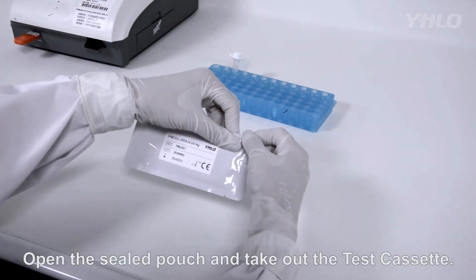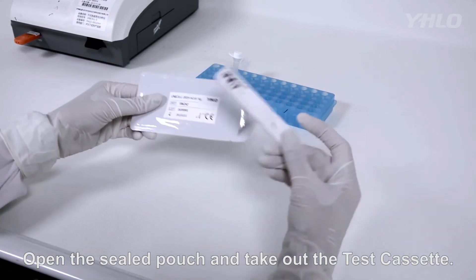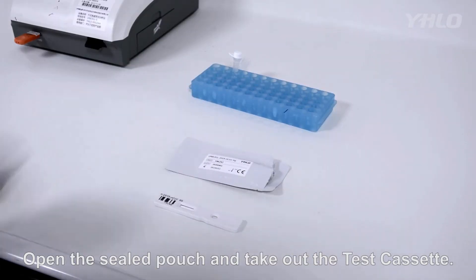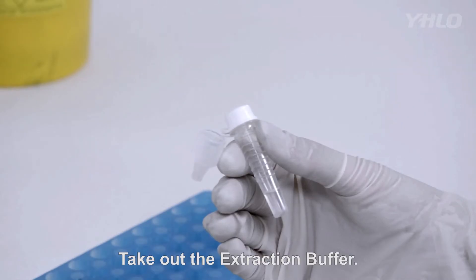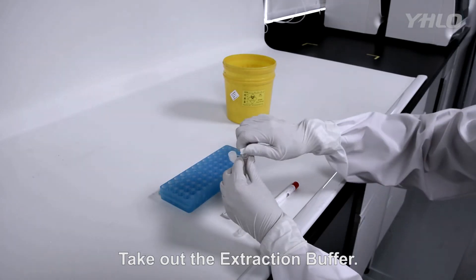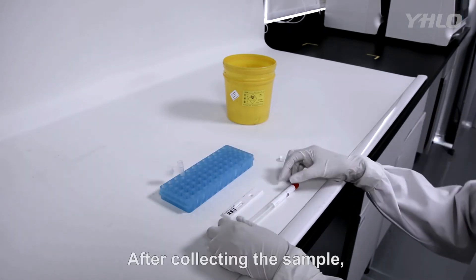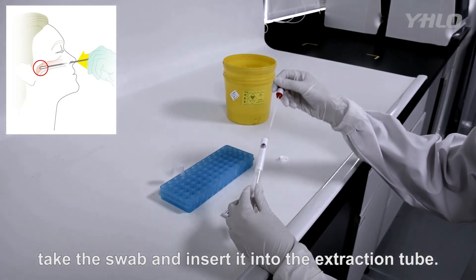Open the sealed pouch and take out the test cassette. Take out the extraction buffer. After collecting the sample, take the swab and insert it into the extraction tube.